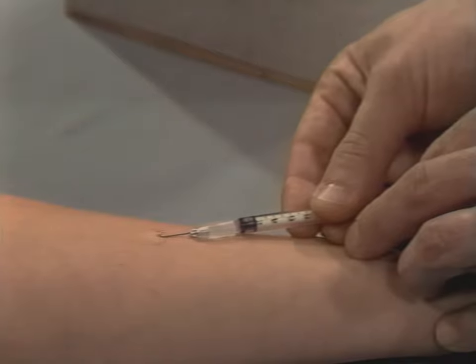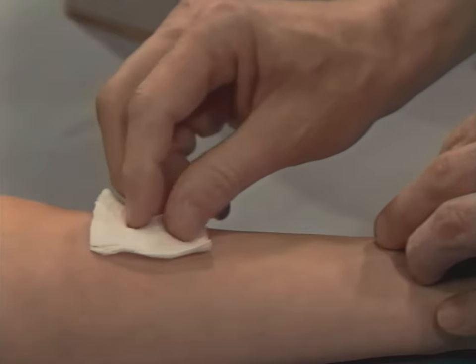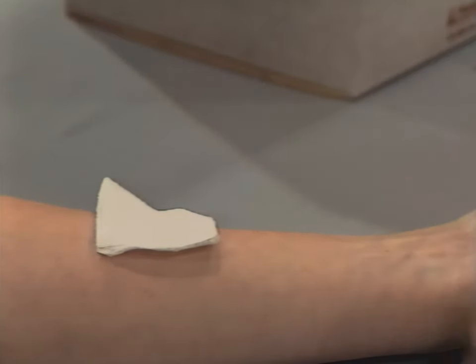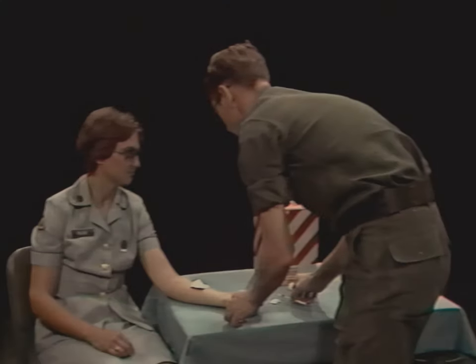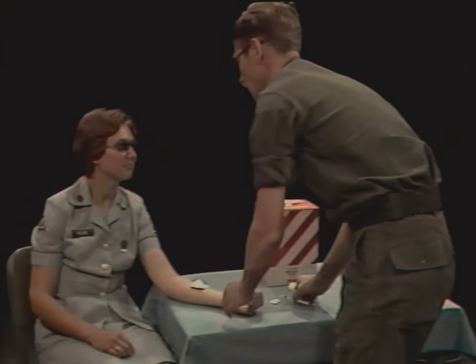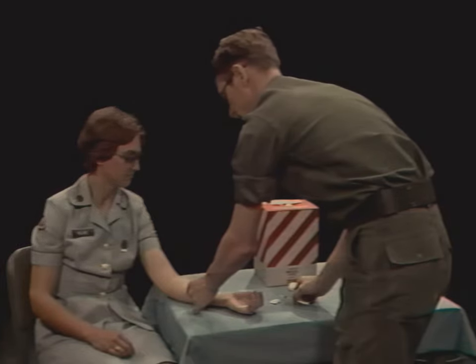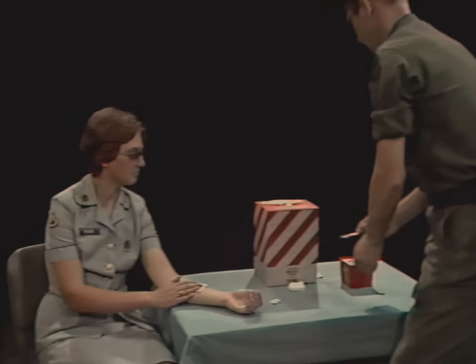Withdraw the needle and blot the site with a dry, sterile sponge. Don't massage the circular bump and caution your patient not to rub or scratch it — you don't want to disperse any of the solution into the underlying tissues. When finished, dispose of your needle and syringe in the appropriate place.